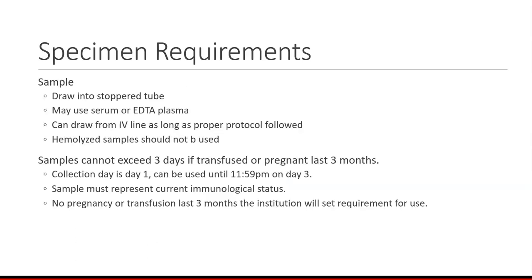So what are the sample requirements? You want to draw it to a stoppered tube. You may use serum or EDTA plasma. That will be determined by your institution. You can draw from IV lines as long as proper protocols are followed. And this would not be you. This would be a licensed person, a nurse. And I still don't feel comfortable with it.